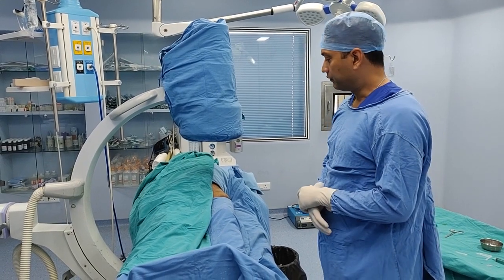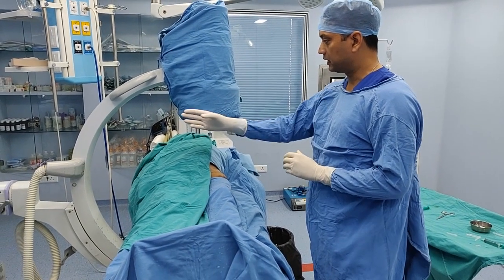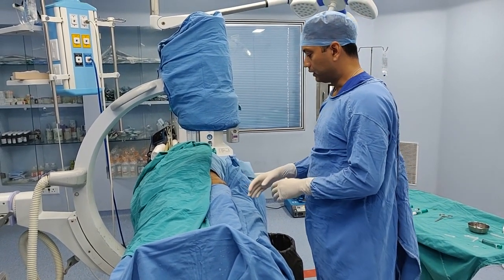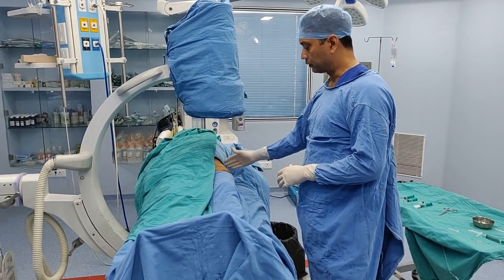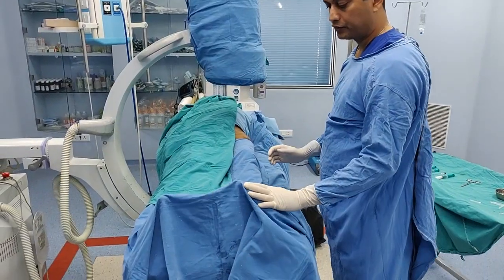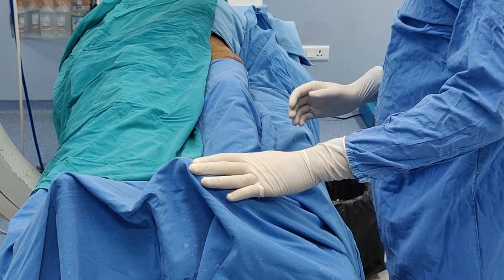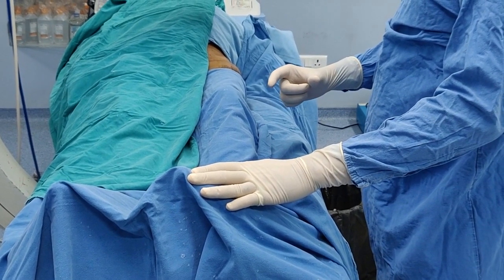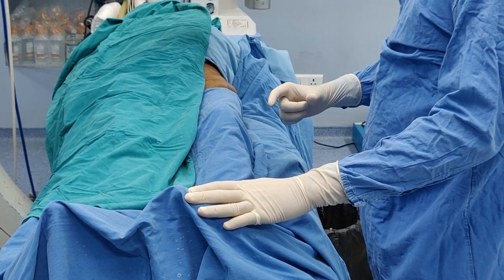So this will be the setting for the injection. The C-arm will come from the opposite side. We have prepped the area that we are going to inject. The leg has to be in slight internal rotation to see the full profile of the neck — that makes your life much easier.